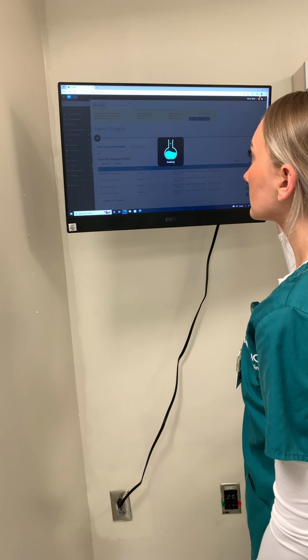All right, I see that I did verify my order, so I'm going to go ahead and introduce myself to my patient. My name's Taylor. I'm going to be your nurse today. I'm going to be performing the dressing change for your central line. Do you have any questions for me?